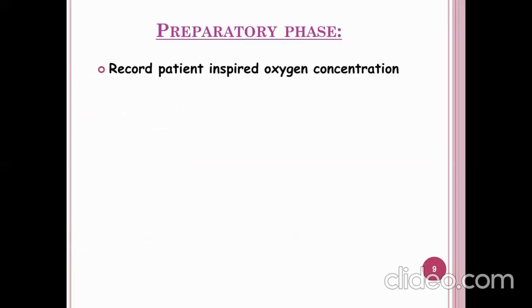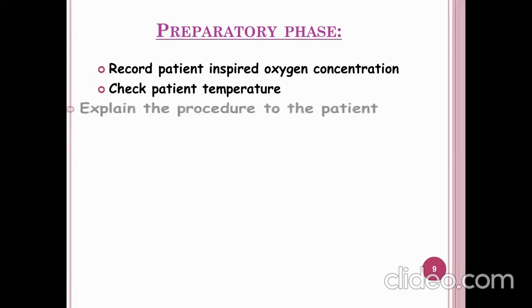So coming to the preparatory phase, record the patient's inspired oxygen concentration. Another point is you have to check the patient's temperature, and we must explain the ABG procedure to the patient because it is quite a painful procedure.